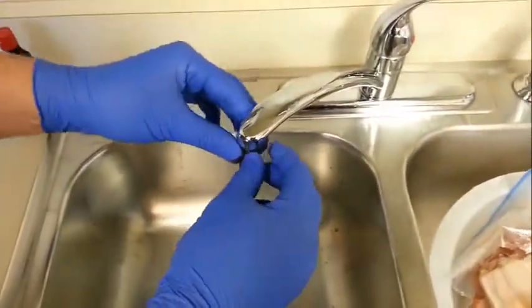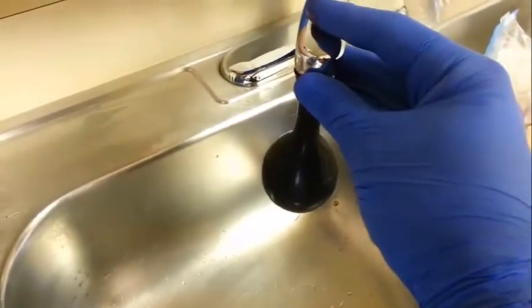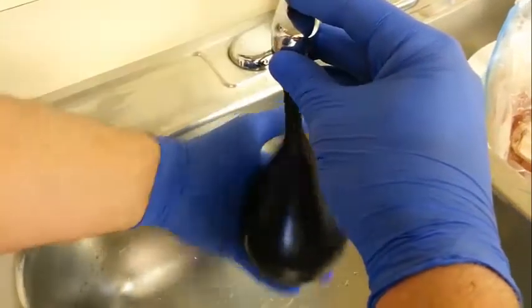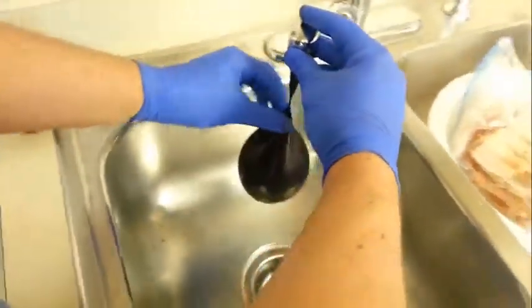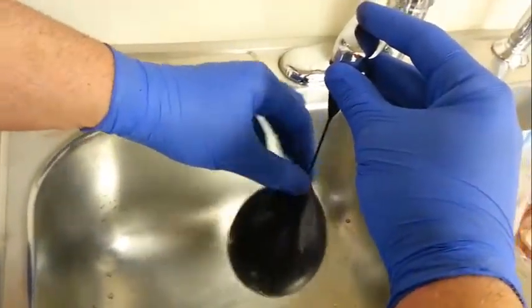depending upon how dark you'd like your cardiac return. Fill the balloon at a standard kitchen faucet to about the size of a fist, or a large orange, or even a small grapefruit — that approximates heart size. This is what's key: twist off the balloon so you don't end up wearing the food coloring.